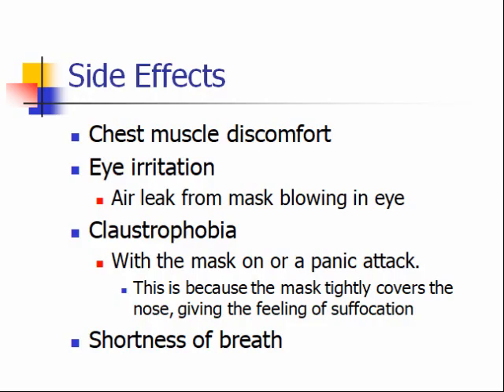It makes them feel like they're being suffocated. In those cases, a nasal mask or nasal pillows, if it can be used, may help them. And along with that is this feeling of shortness of breath. You have this pressure pushing on you, and some people feel like it's making them have problems with breathing.